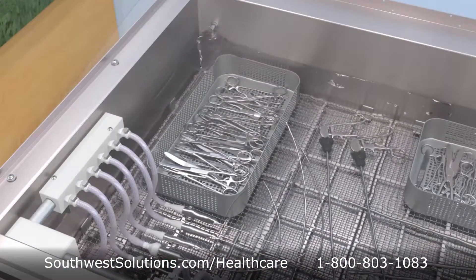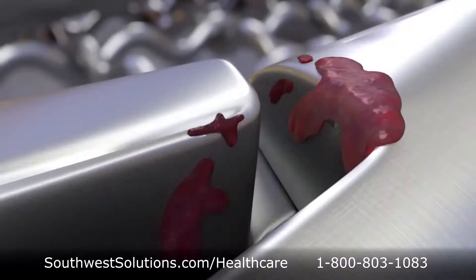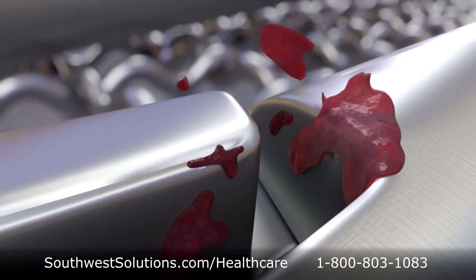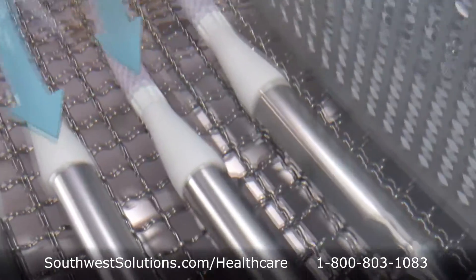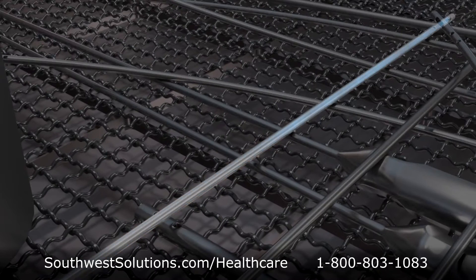The wash tank is filled with 120 degree water that is dosed with enzymatic solution, loosening blood and other unintended debris from the instrument. During the 21 minute soak, the ports direct a flow of solution along the interior surface of the cannulated instruments, allowing instruments to sit with enzymatic solution inside.